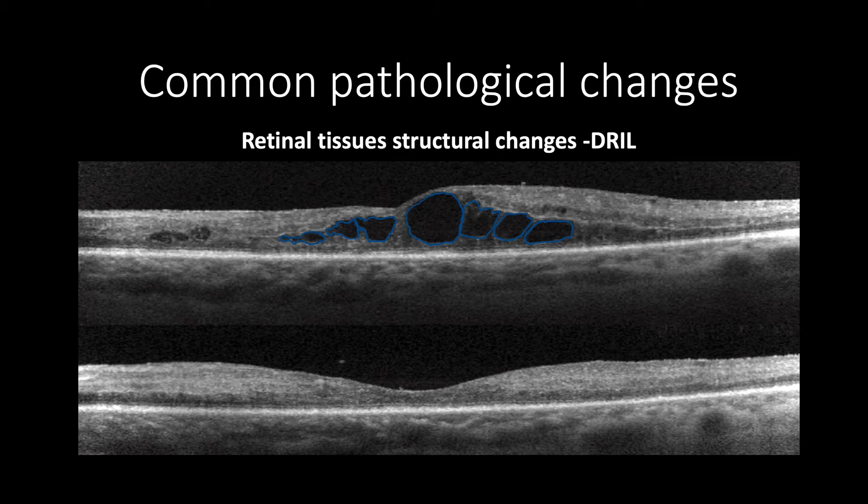The second cross-section shows resolved edema after treatment but shows poor to no visible boundaries between inner retinal layers.